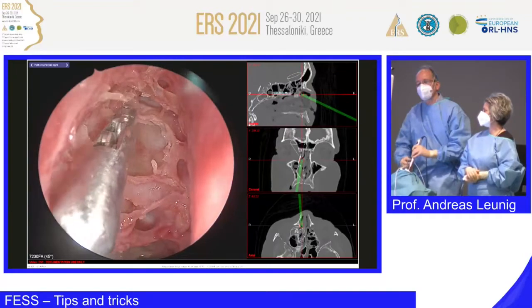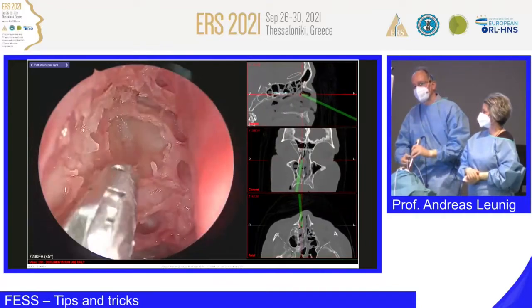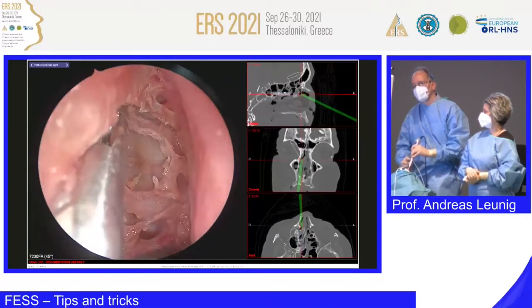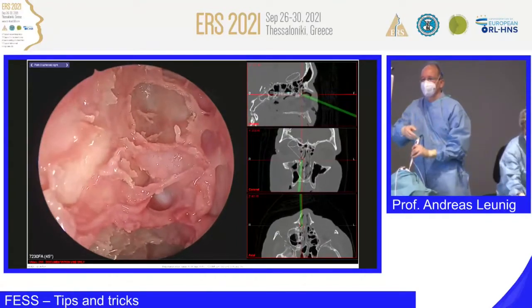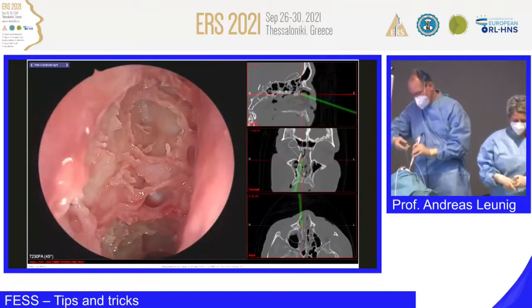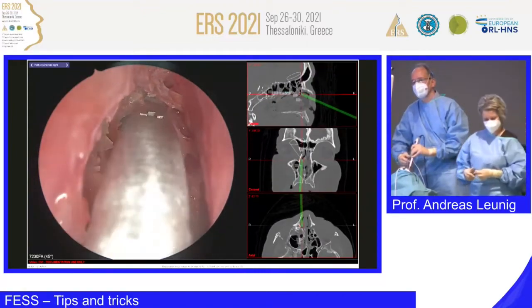We're going up here. Taking the bony lamellas out again. The orbit is quite weak here, so pay attention. I clean it a little bit more. Okay, so we still have something to resect here. That's not skull base here. This here, that's not skull base. But I can show you by navigation.